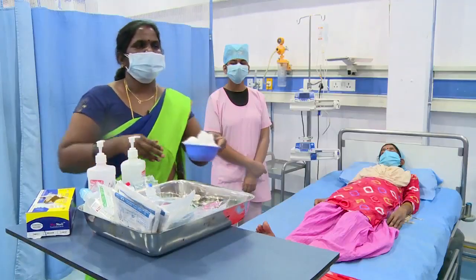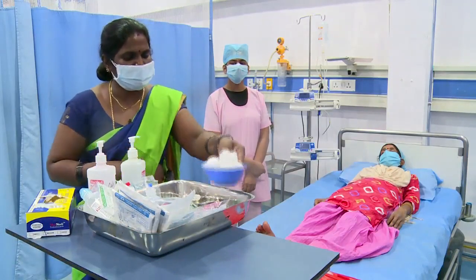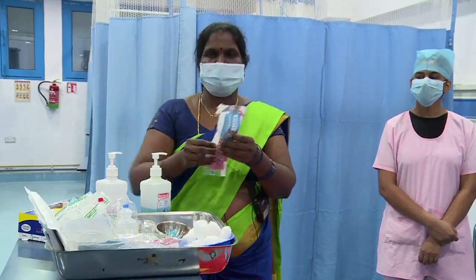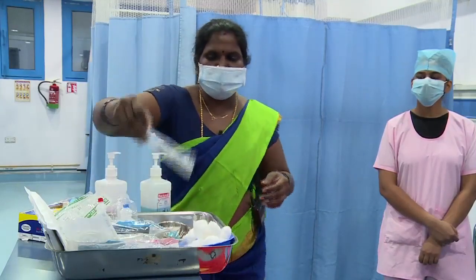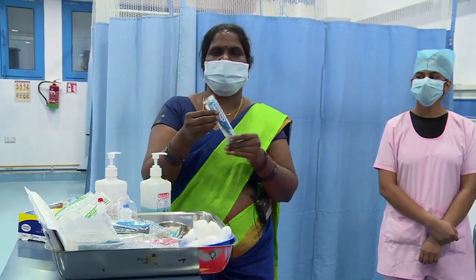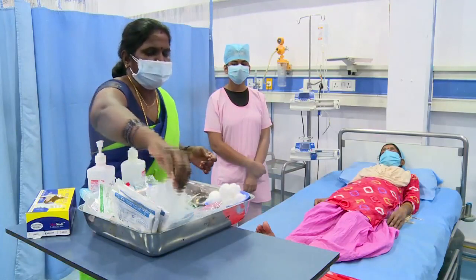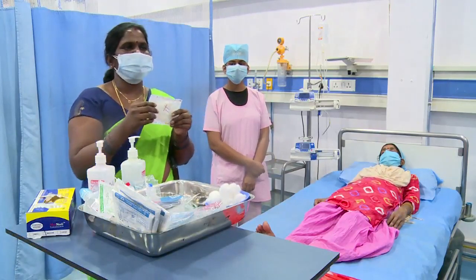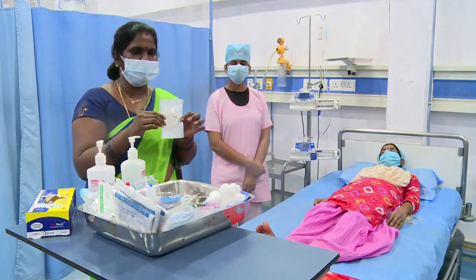A bowl with cotton for wiping and for cutting the ampoule. A 50 ml syringe for infusion of inotropic drugs. A 5 ml syringe for diluting the medicines from the fluid for injections. This is the extension tube from the 50 ml syringe to the patient's IV connection that we can use.